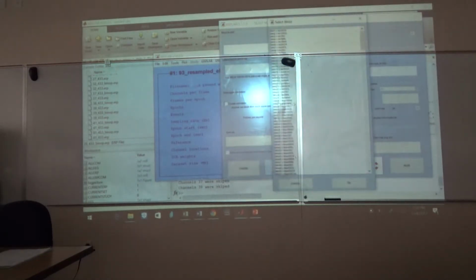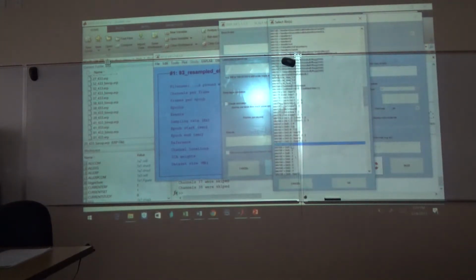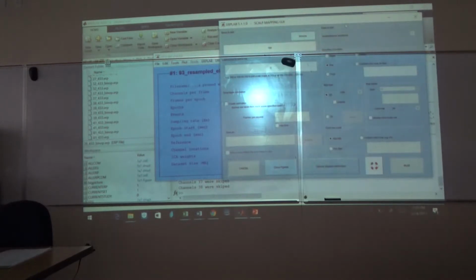So I want to find the difference between old hits that were 4 and 5. We need to plot our difference maps. I'm pretty sure that's bin 188. Let me just make sure that is correct. So I can select bin 188. The value to plot is the mean amplitude, so why don't we do between 600 and 900 milliseconds.